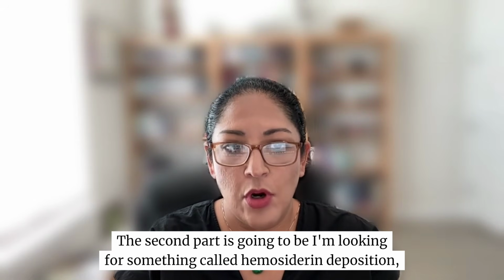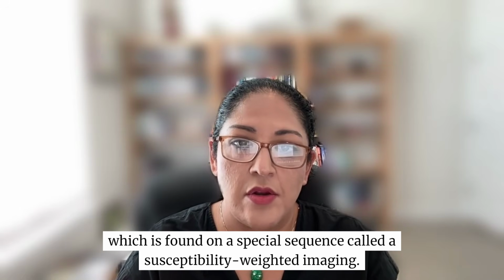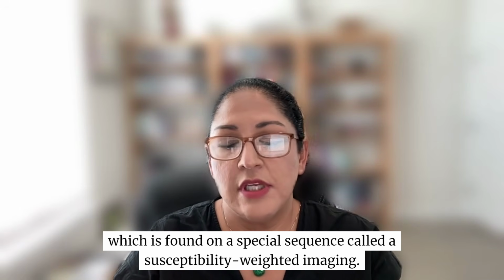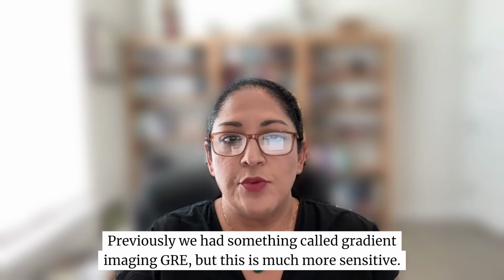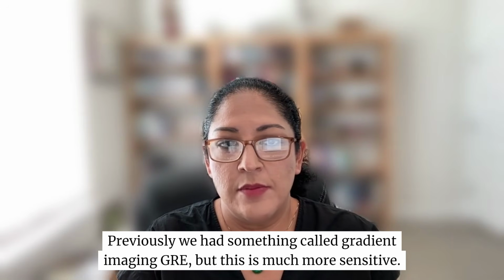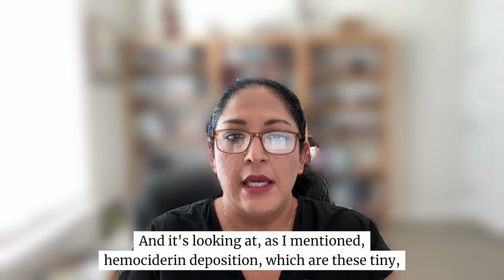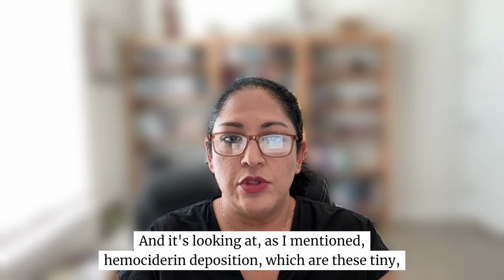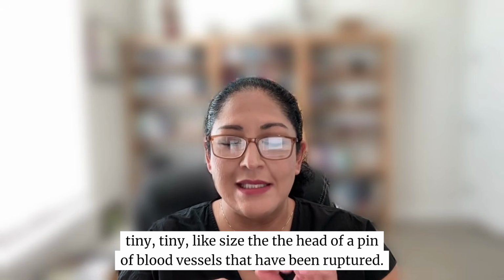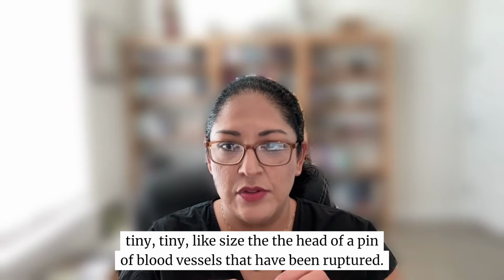The second part is I'm looking for something called hemosiderin deposition, which is found on a special sequence called susceptibility-weighted imaging. Previously, we had something called gradient imaging, GRE, but this is much more sensitive. And it's looking at, as I mentioned, hemosiderin deposition, which are these tiny, tiny, tiny, like size the head of a pin, blood vessels that have been ruptured.